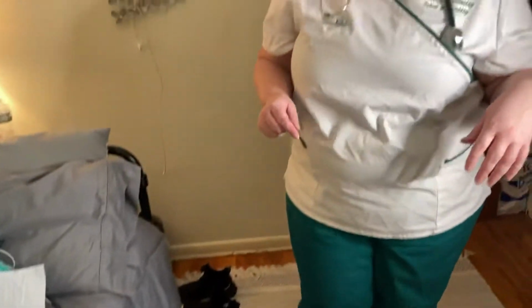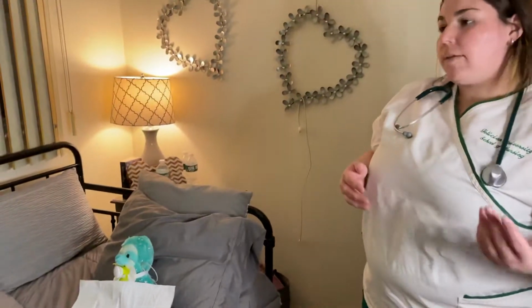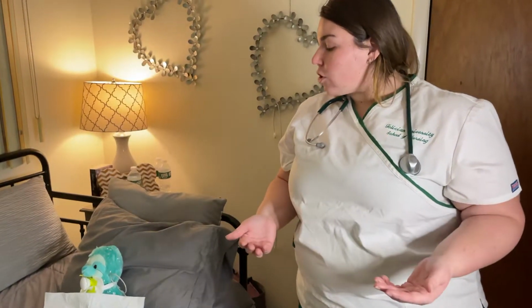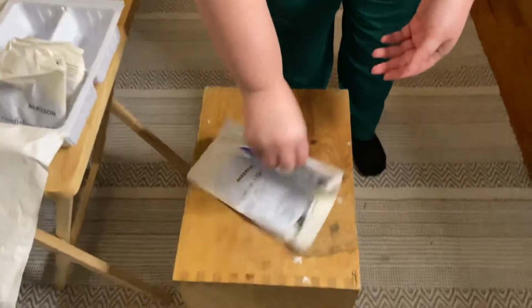Okay, so the first thing I'm going to do is, Mrs. Gerban, do you have any allergies? I have no known drug allergies, but I am allergic to strawberries and bees. Okay, so with that, we're going to begin your trach suction and your trach care. I'm going to put my sterile gloves on.